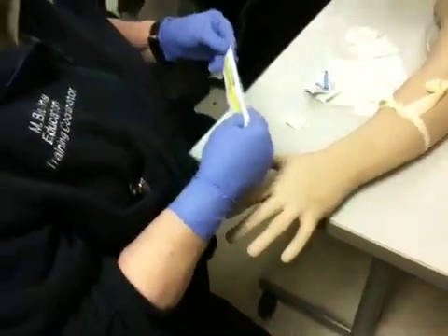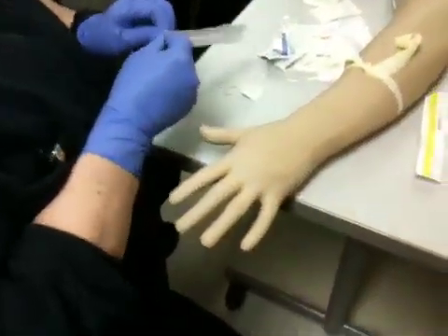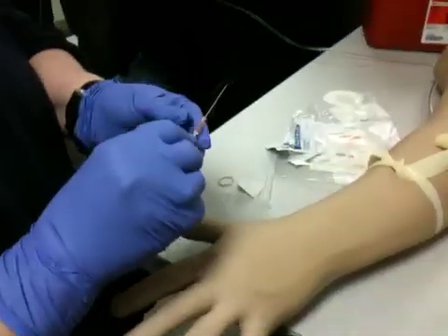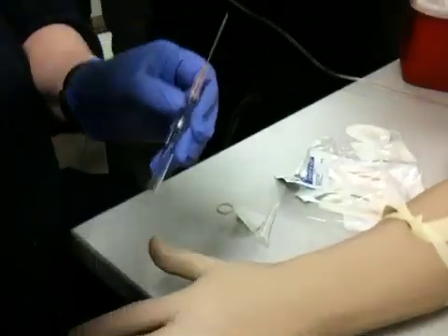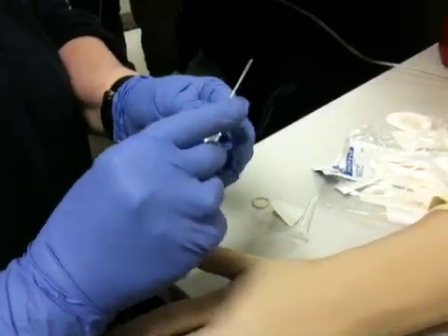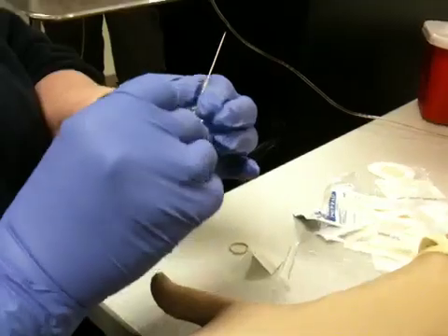I'm looking at my IV catheter — 24. Actually, I think I'll probably get a 20 in this one. Check the expiration date. Now, when I look at an IV catheter, I want to look and make sure that the bevel — or the slice or opening — is pointed up. So the first thing I want to do is make sure the bevel is up. Also make sure that the catheter itself can rotate on the needle, because a lot of 20 gauge and 24 gauges have a tendency to stick. So we just go around and around.